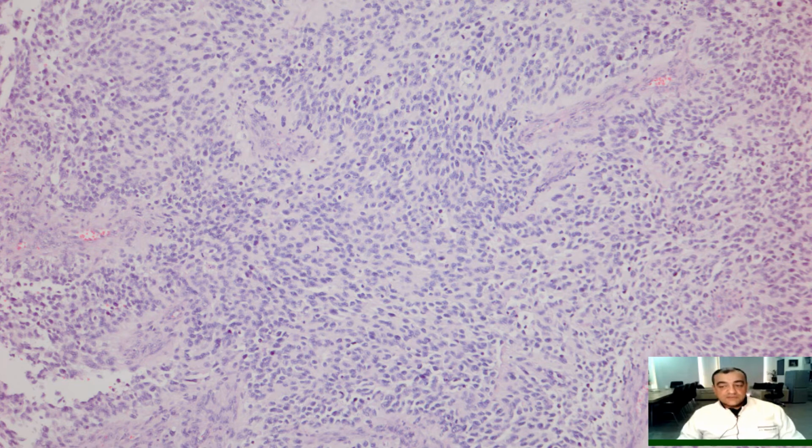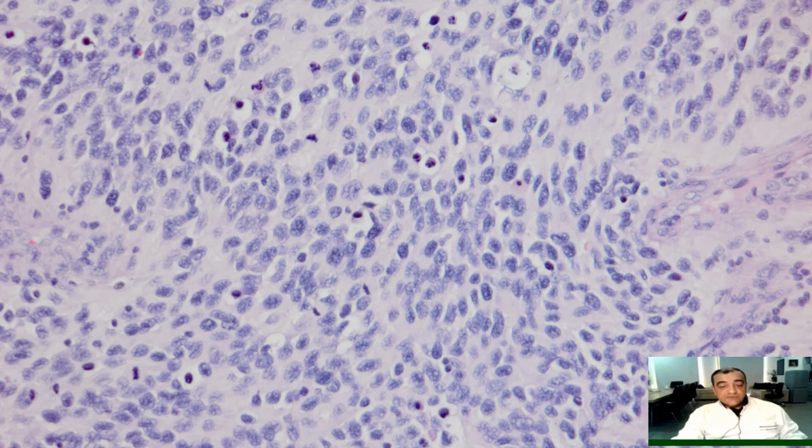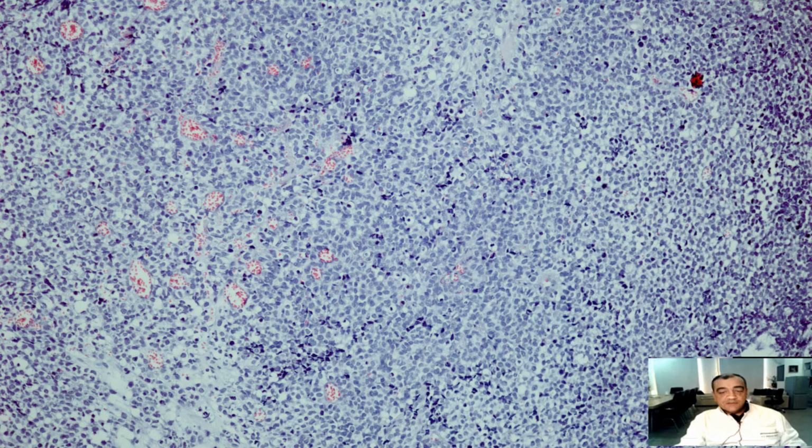Here, of course, by histology, we cannot at once recognize that we deal with myogenic origin, because we see more or less the same picture, that is diffuse solid growth of small to medium-sized neoplastic cells, which have an uneven distribution of chromatin, hyperchromasia of the cells, nuclear overcrowding, many atypical mitoses, and individual tumor cell apoptosis and necrosis, which is a commonly seen picture in all types of small blue round cell tumor.